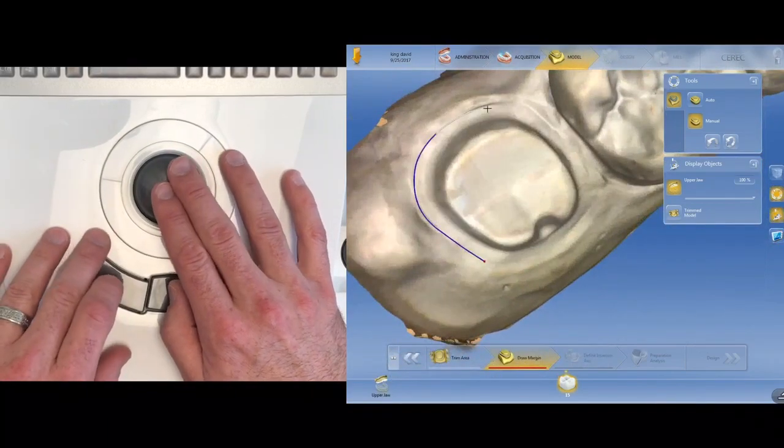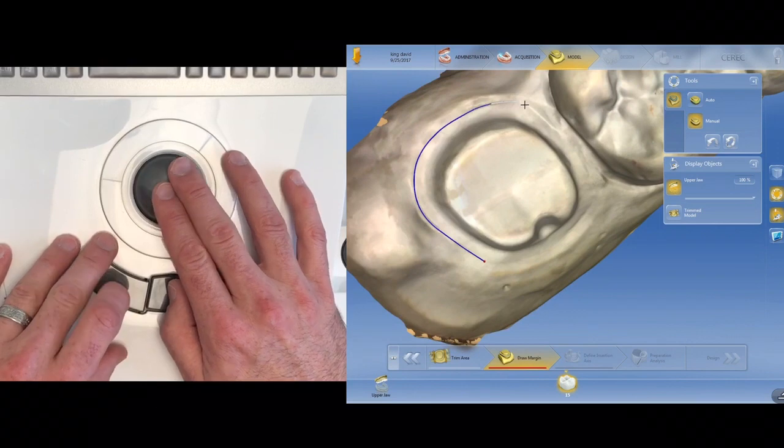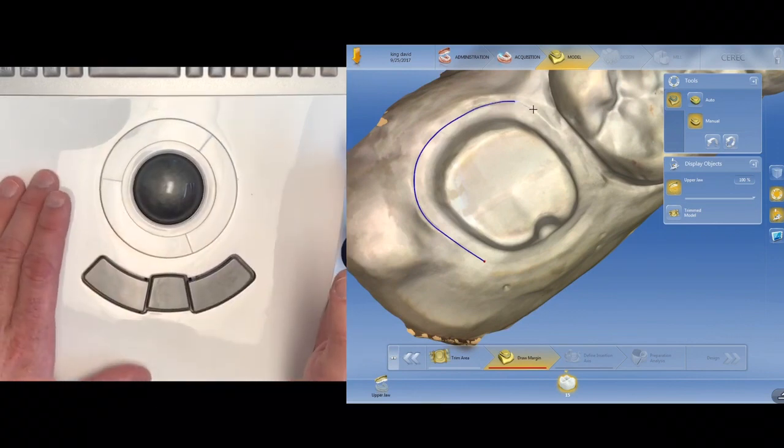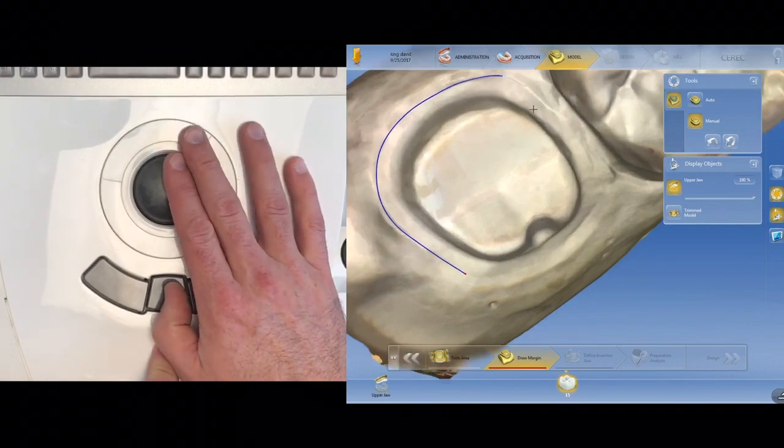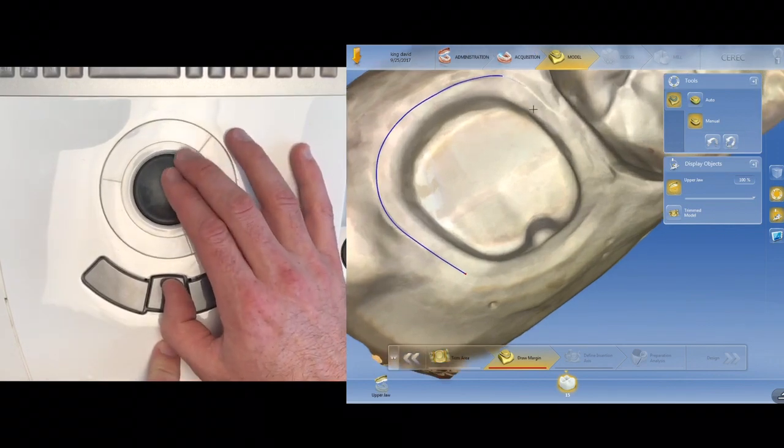All right, so let's go through and select a little bit more. Let's just say I want to zoom in on this area. What am I going to use? I'm going to use that center button. Press and hold and zoom in. Now that's as far as it'll zoom in.